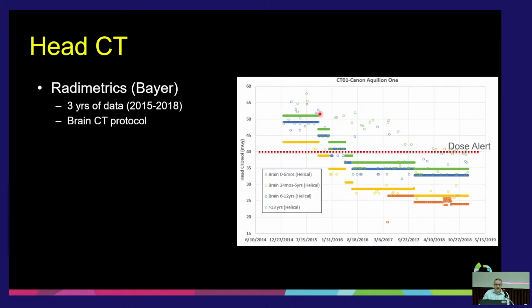So what we did is basically every 2 or 3 months, we reduced it by about 10%. And then we would operate it for 3 months or so, and we would go back to the neuroradiologist, because this is a brain example, and ask them, how comfortable are you with this quality of image? Can you see what you need to see? Were there ever times where you really struggled to make your diagnosis? And they would almost always say, we're perfectly comfortable with this dose setting. So then we would go turn it down another 10%.